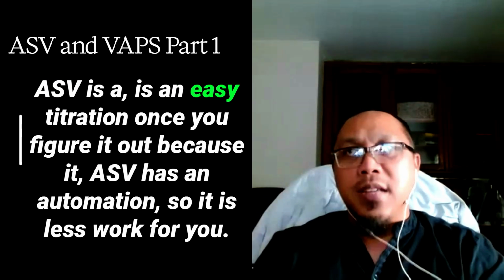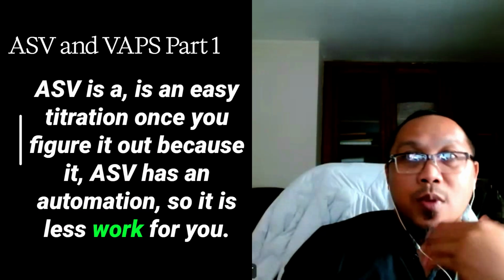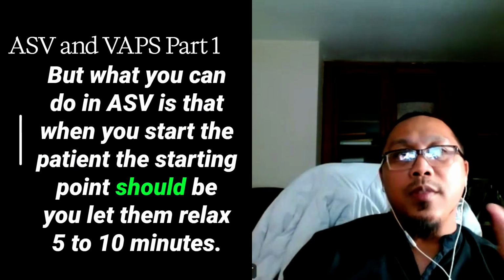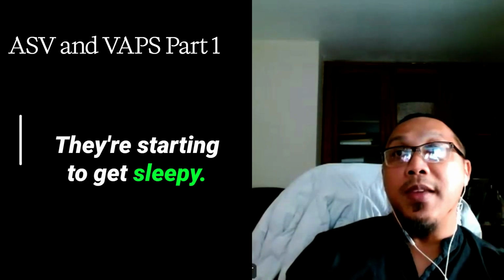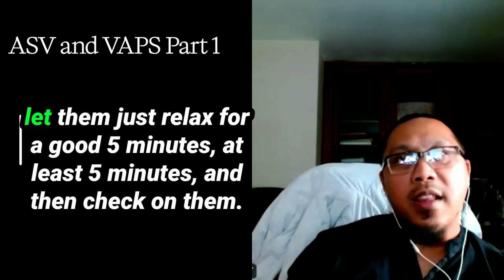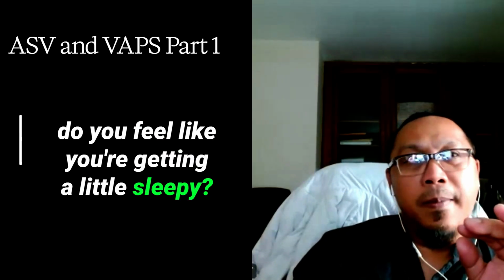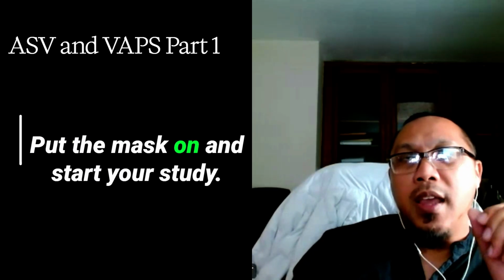Any questions? ASV is an easy titration once you figure it out, because ASV has an automation, so it's less work for you. But what you can do in ASV is that when you start the patient, the starting point should be you let them relax 5 to 10 minutes. Once they're comfortable, like they're starting to get sleepy, that's when you put the mask on. You can even start the patient calibration and then let them just relax for a good 5 minutes, at least 5 minutes. And then check on them. Are you okay? Do you feel like you're getting a little sleepy? Oh, yeah, I'm comfortable now. Okay, then we can start, right? Put the mask on and start your study.